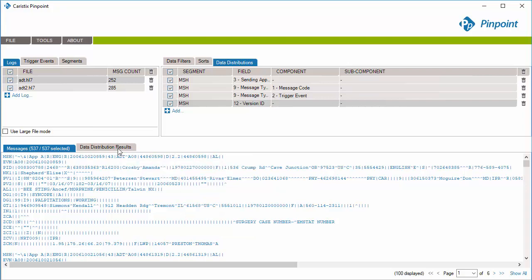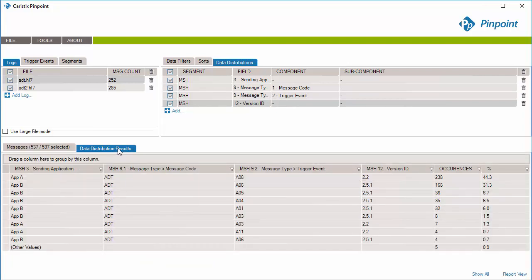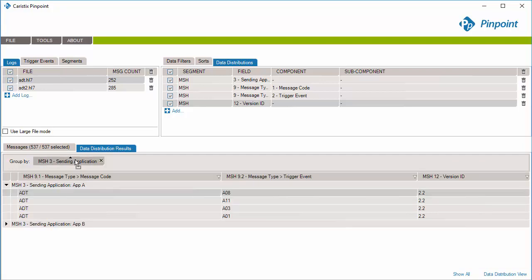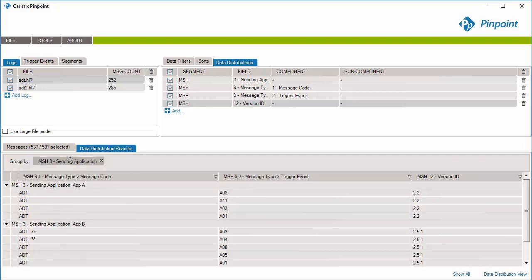Now, navigate to the Data Distribution Results tab and click the Report View link. See? All combinations of the selected field values are listed. You can now group them on the Sending Application field and get a quick overview of the trigger events and HL7 versions exchanged between systems.